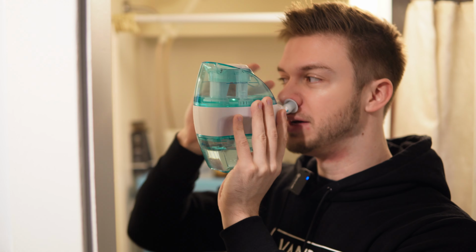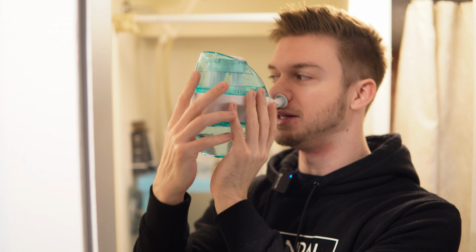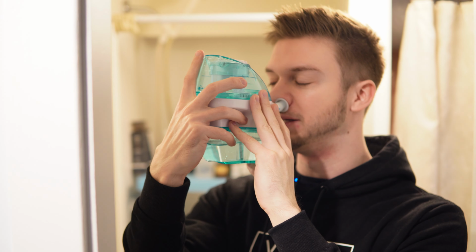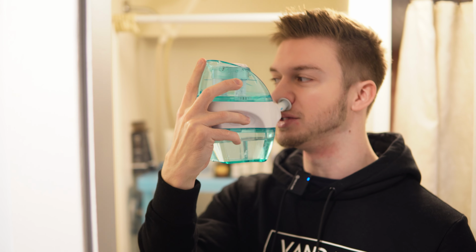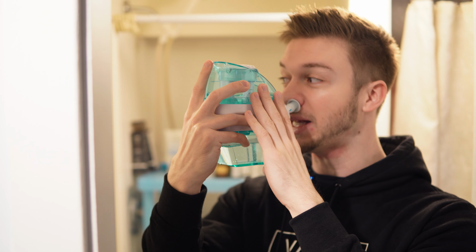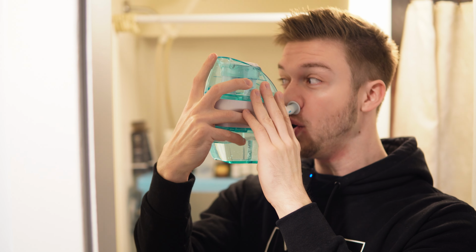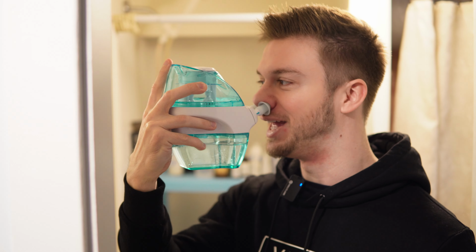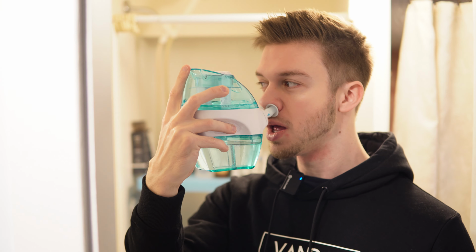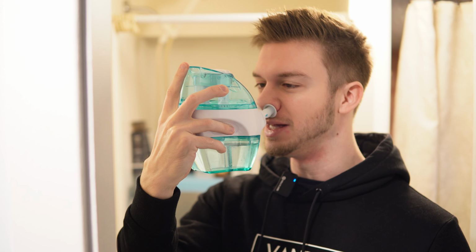Sometimes I like to just take it out, give it a second to breathe, and then go back into it as well. This is actually coming through fairly quickly, but sometimes it will take a little bit more time. Whew! So yeah, that is how you use the Navage Nasal Irrigation System. Pretty straightforward. You can get a lot of gunk out, so whew! And that's about it.